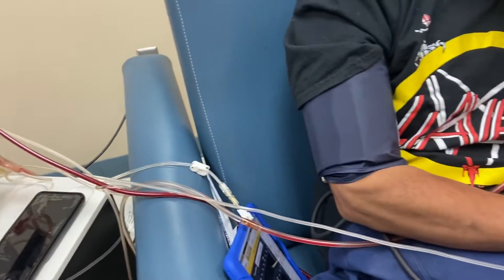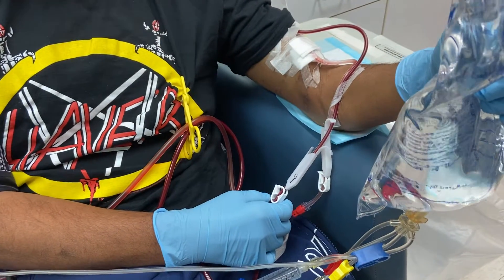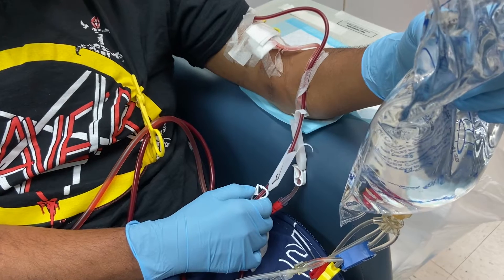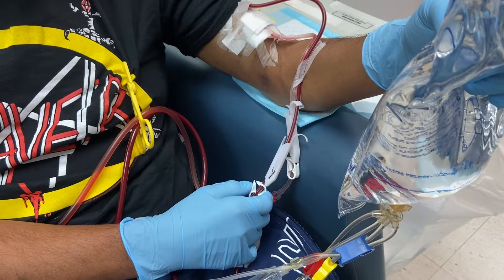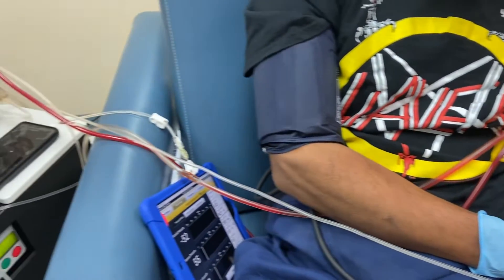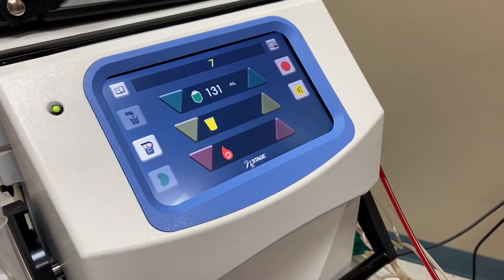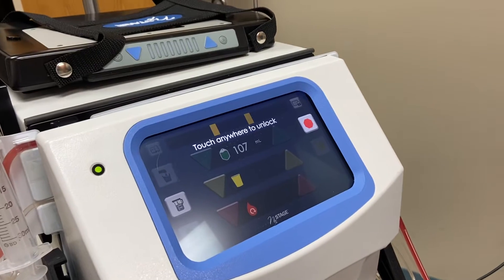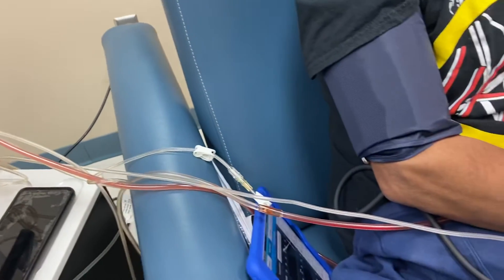Now he is not squeezing the saline. The right hand should be ready to close as soon as the venous line is clear. So we will finish the whole 277, so we will not get an alarm. See the line is now getting clearer.